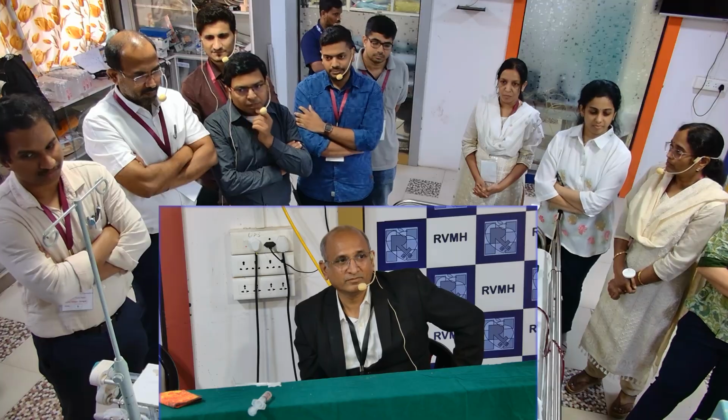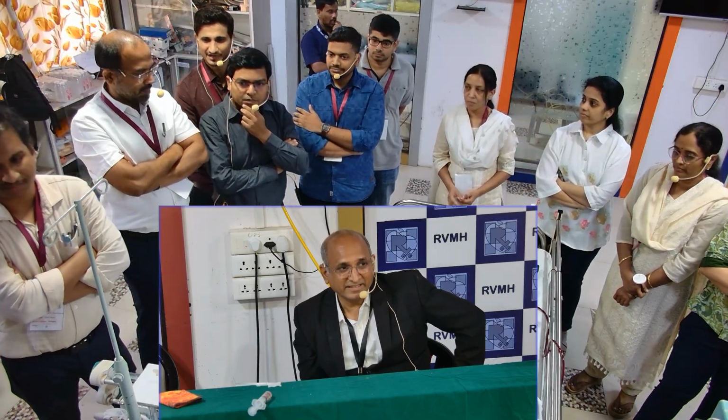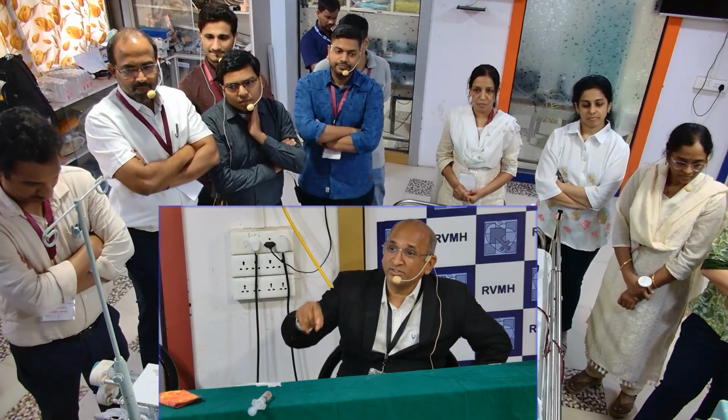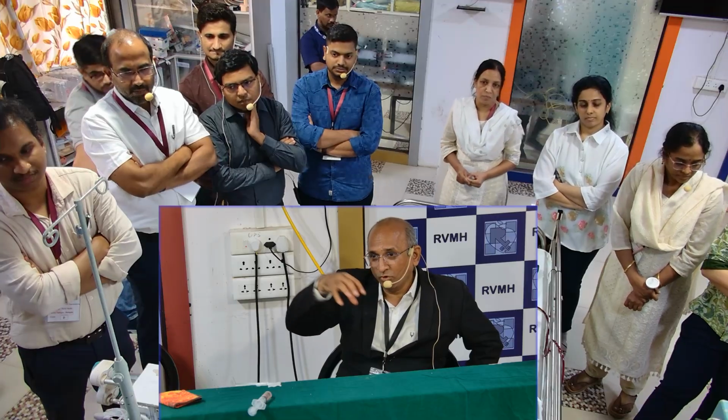Okay. Sir, we have to identify which component of the machine is involved. So we have to take care of that particular segment. Once you know it's the machine, then you have to focus on which component of the machine is creating a problem. So then go more specific.